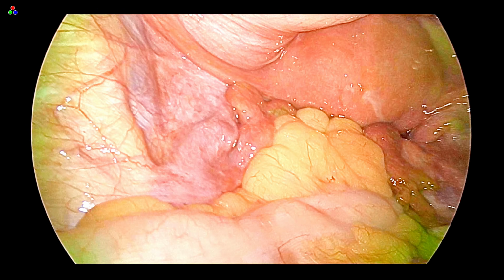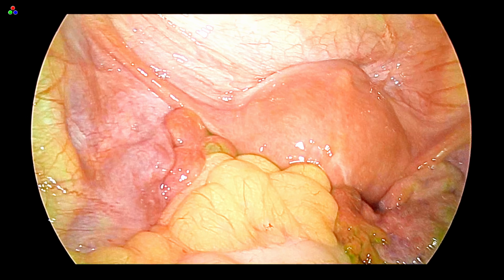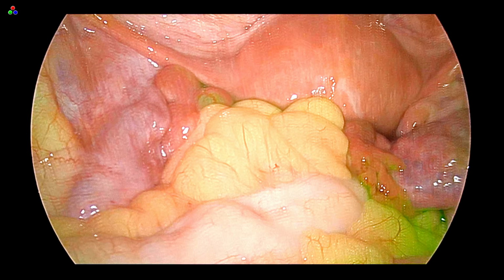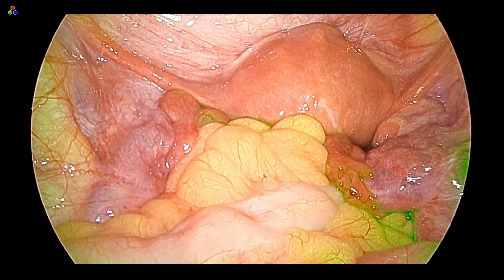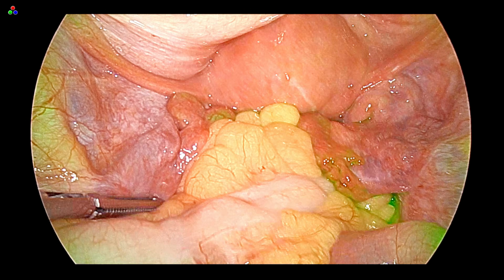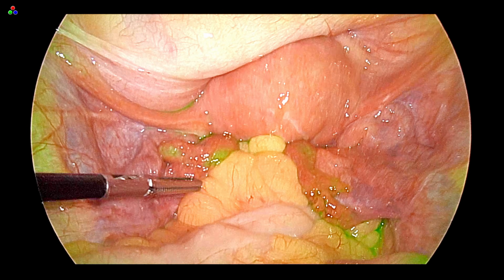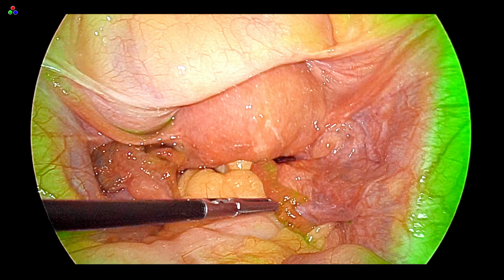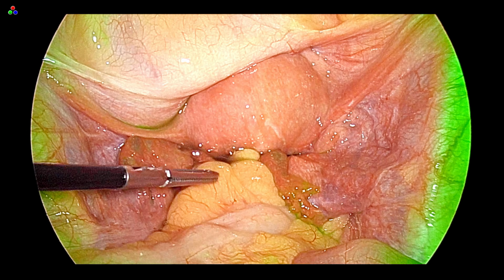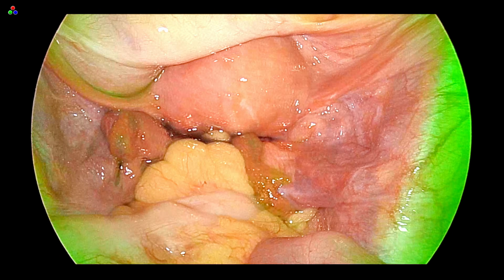This side also the dye is coming. You can take an atraumatic grasper and you can lift the tube, and you can see the dye, and then you can change to a different mode. ICG has the contrast mode, ENV mode, CSF mode, and the overlay mode. So they can scan both sides. The ICG is nicely coming, and then you can change to contrast mode.